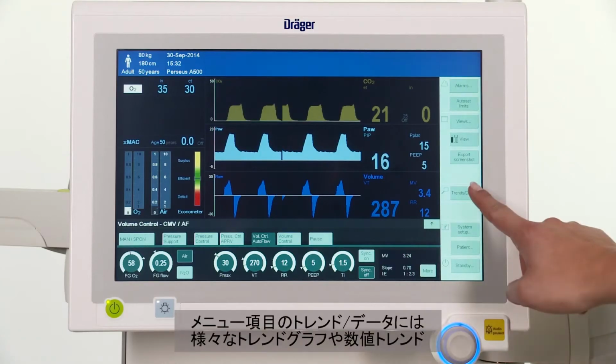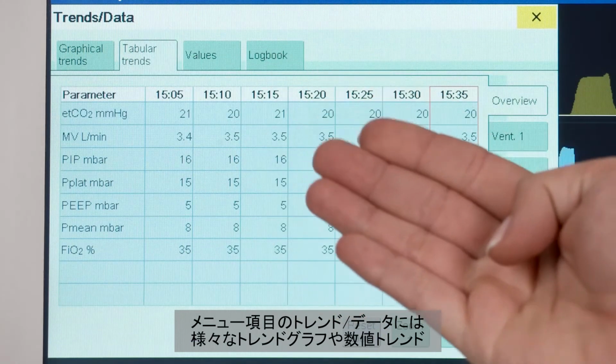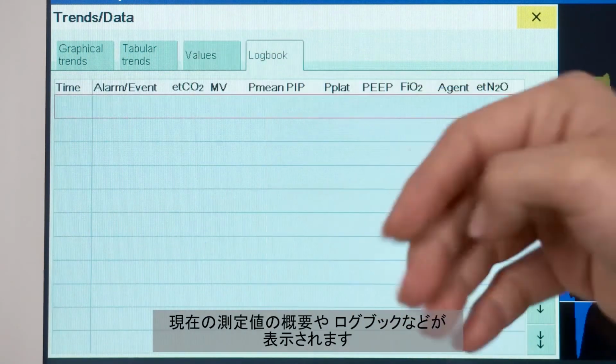The menu item Trends Data contains various graphical and tabular trends, overviews of current measured values, as well as the logbook.